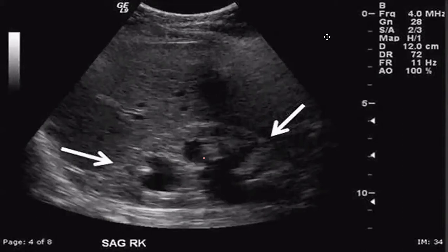So remember always, this is the ureter. I always tell you, all of you, that if the ureter is not dilated, you cannot actually see it in ultrasound, simply because the overlying bowel gases look white in ultrasound. They can obscure the ureters.